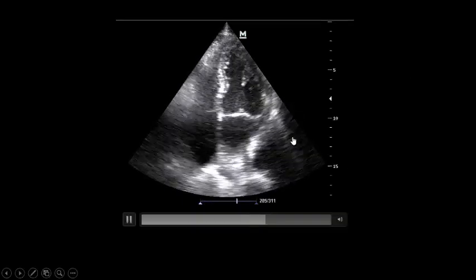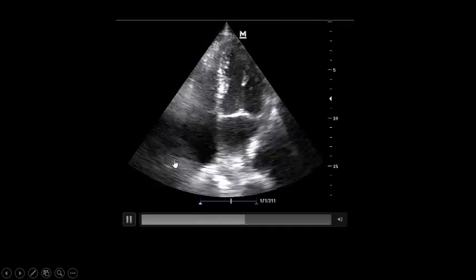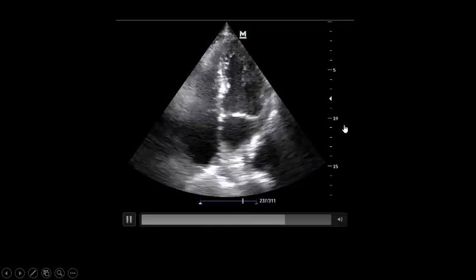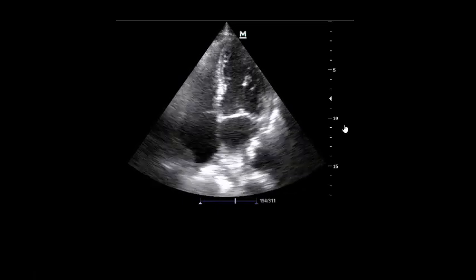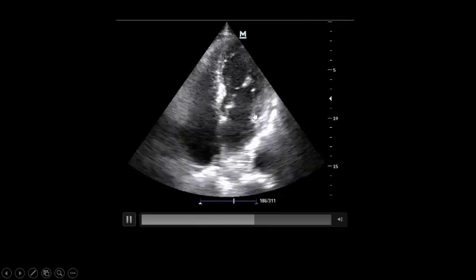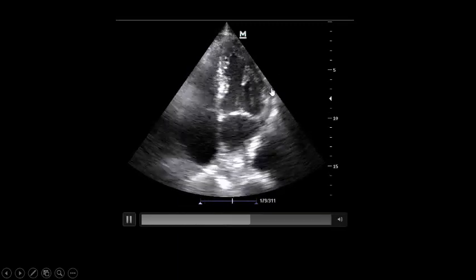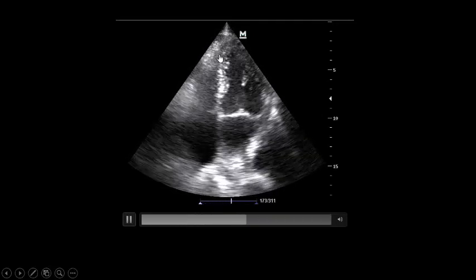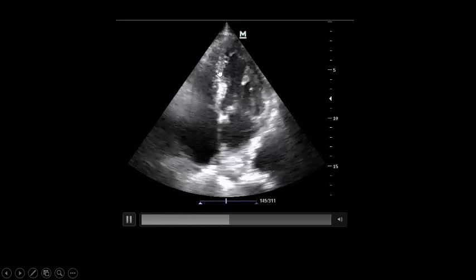As you see here, this is the four-chamber view: left atrium, left ventricle, right atrium, right ventricle, tricuspid valve, mitral valve. Visual assessment of ejection fraction — you are talking about 45–50% in this view. The left ventricle is not dilated. Regarding wall motion abnormality, as you see here the lateral wall is moving, but there is hypokinesia in the apical part of the septum.